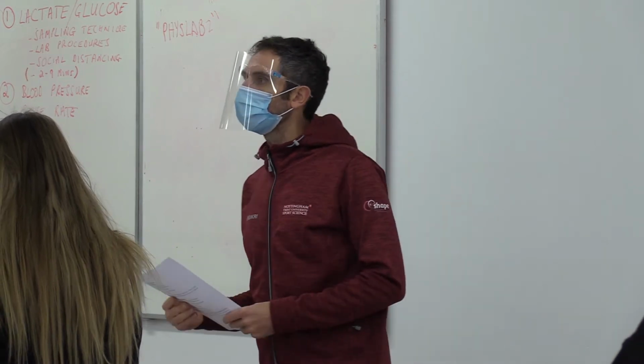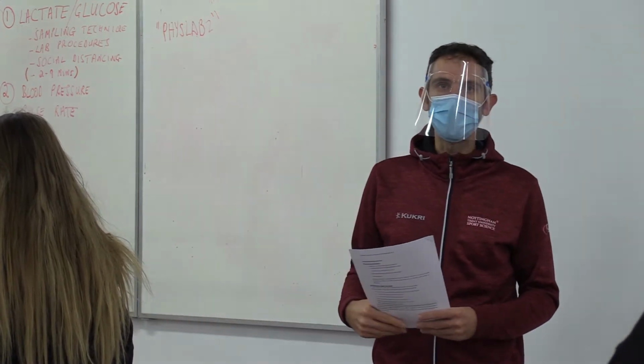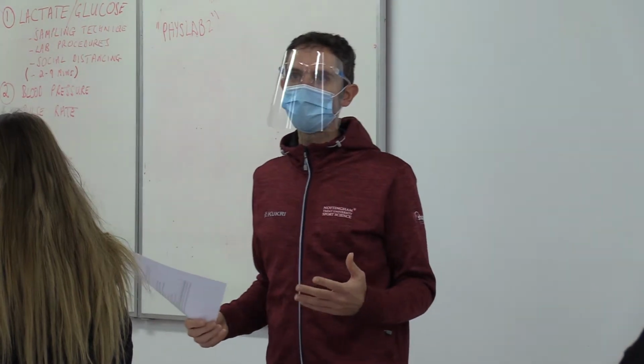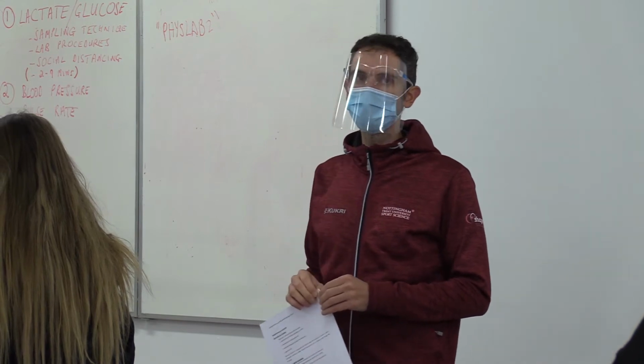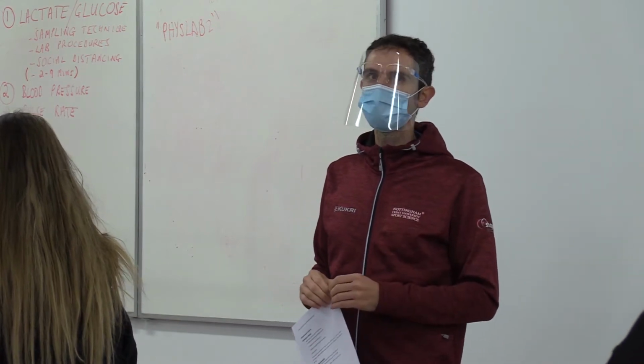Okay. So if anyone has a guess, or do they know why we might be interested in someone's VO2? Why would we be interested in the amount of oxygen someone utilises during an exercise test?